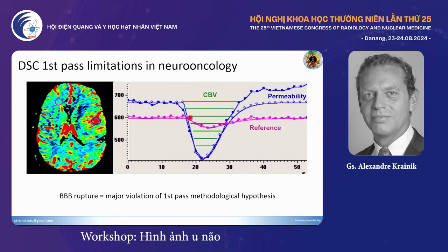And you see, when you consider the normal value in pink, you can estimate a CBV, but in blue, you will have an increase of the signal drop due to the increased quantity and density of blood vessels in your voxels. But the problem is that because there's some contrast enhancement, you will have this permeability effect. The bolus will get out of the vessel.